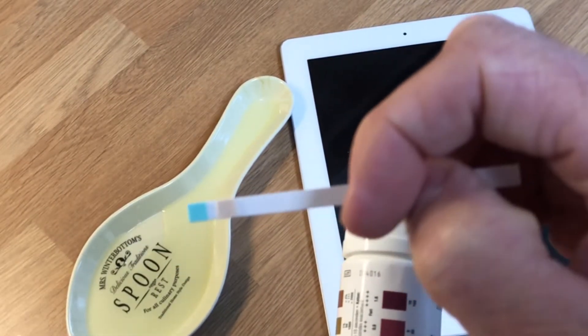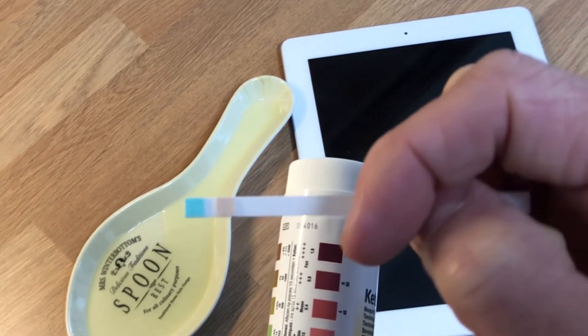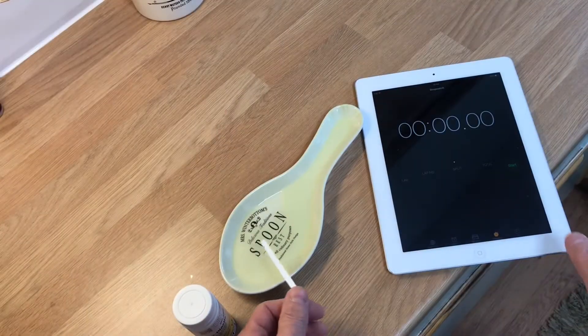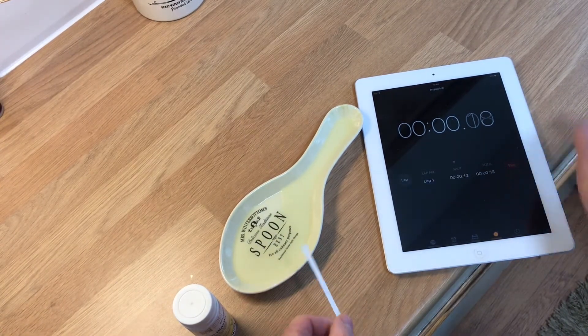You need a stopwatch and a container for your wee sample. It's a spoon holder, but it's ideal for female dogs when they're squatting — you make do with what you've got.